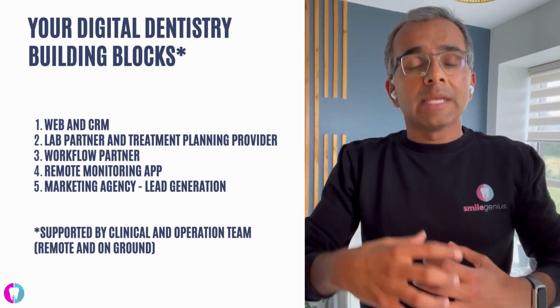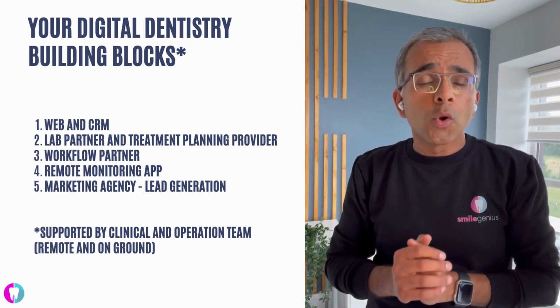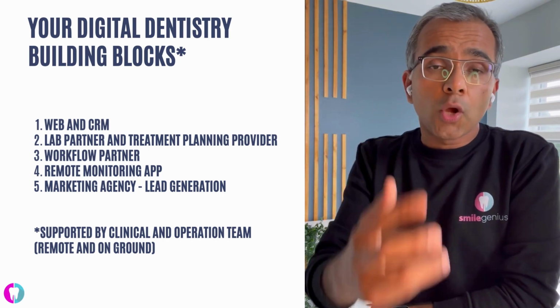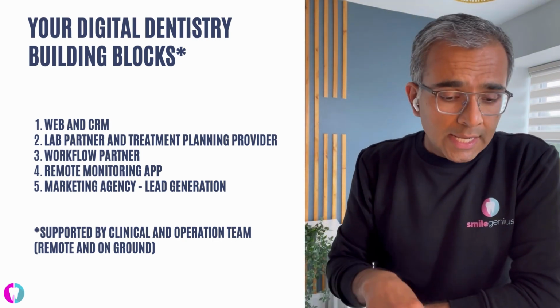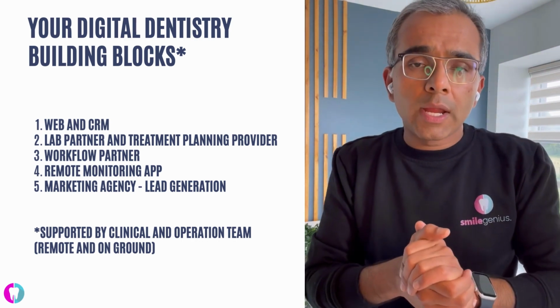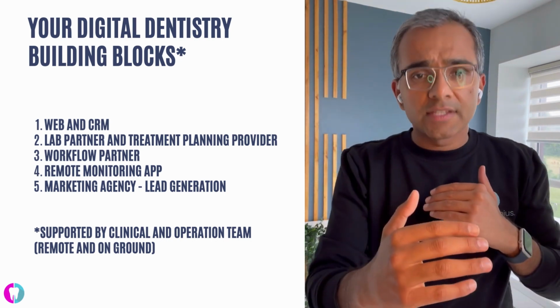But again, you need to have another partner in the mix who can scan those impressions for you. So identifying which scanner you are trying to buy, talking to the lab partner, and then maybe a treatment planning provider, whether in your geography or overseas, is very important. And then that's when you enter into workflow management, where you will need a lab case management platform where you can send the cases to the lab.